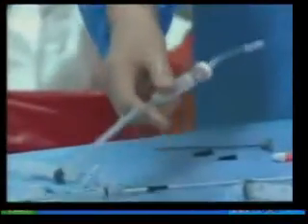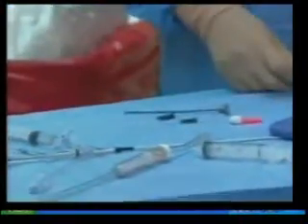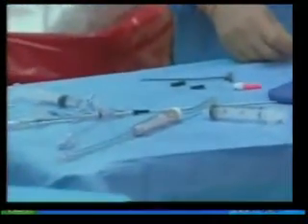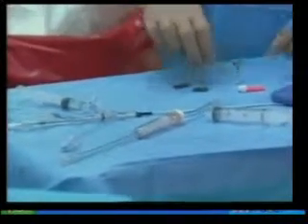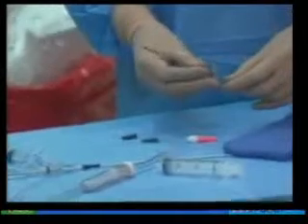So we'll create an AV fistula from the carotid. So the benefit, Ty, is that the arterial blood flows through that filter back into a vein, right? So the blood isn't lost. That's correct. So we can either have active or passive aspiration when we do that, or reversal.